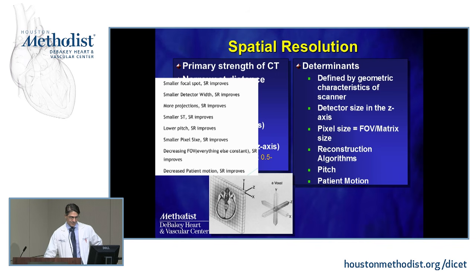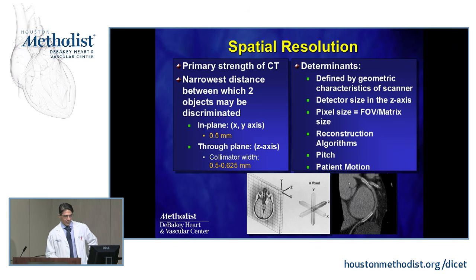Okay, this was me making slides better yesterday. So we've talked about temporal resolution. Now, of course, the other important thing is spatial resolution. This is where CT is king. No one beats us. We have the best spatial resolution of any imaging technique there is, other than a patient who goes to the cath lab.